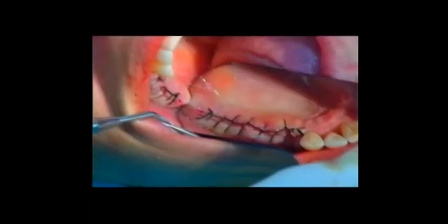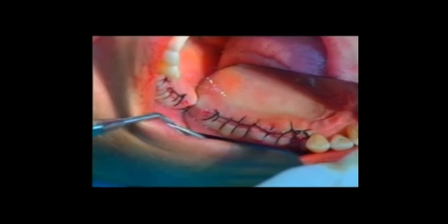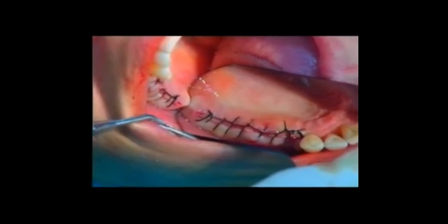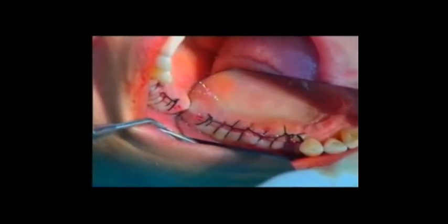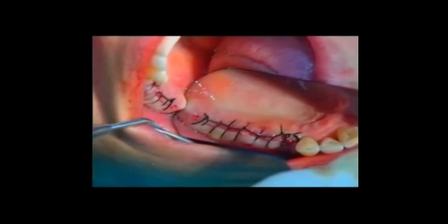Primary closure is performed with continuous sutures in the horizontal incision and a simple suture in the vertical incision.